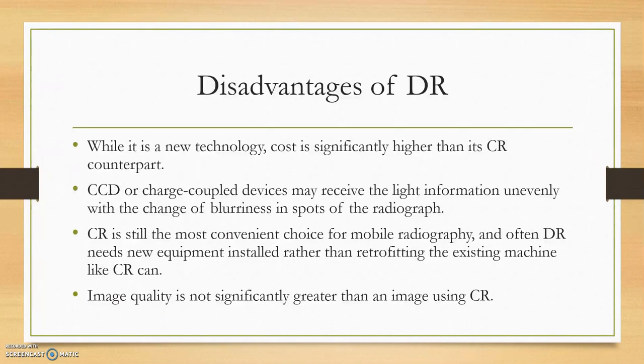So disadvantages of DR are that it's a new technology. It's significantly more expensive than CR. CCD isn't quite worked out as well yet as the TFT option of direct radiography. CR is still the most convenient choice over DR for mobile radiography. That's the one that's been tried and true. It's tested to be the best at the moment. And image quality isn't quite as much higher as how much more it costs than CR.